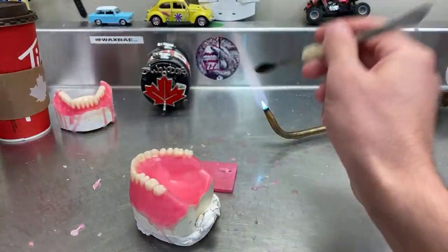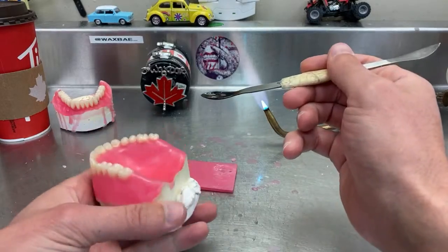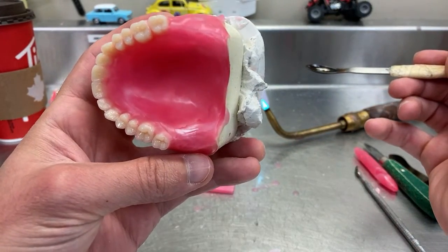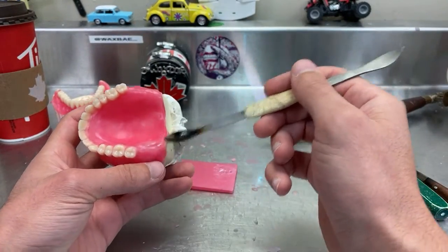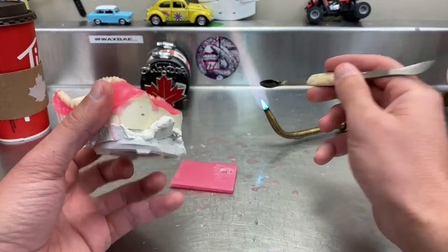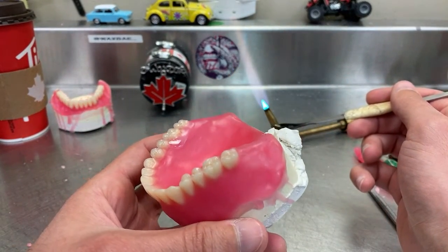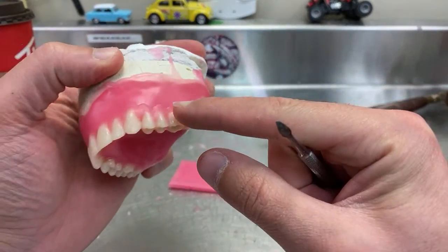So what you want is the wax in a liquid state, not very, very hot, because that will be bad as well. And then once it touches the cold wax, you will see it just takes it from you. Those little things are actually what makes the difference in your work. Maybe a little here. So anyway, you get the point. Now we're back to this. You see where I added the wax here, now it's nice and cool.